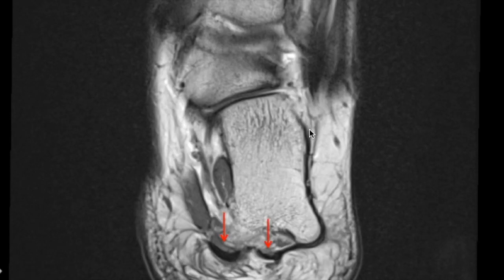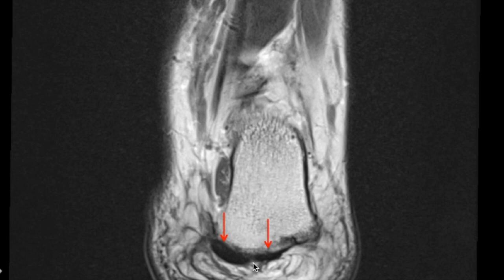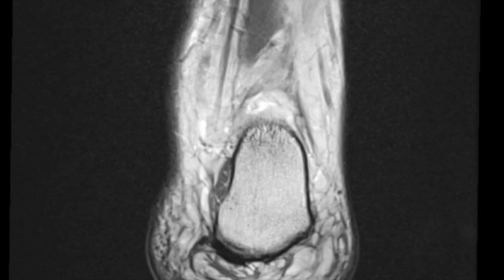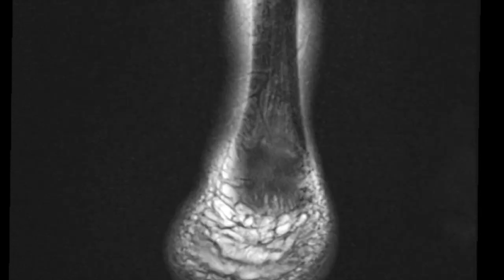The next is the plantar fascia — this is the central band and this is the lateral band of the plantar fascia, which attaches to the calcaneum. The posterior most structure is the Achilles tendon.